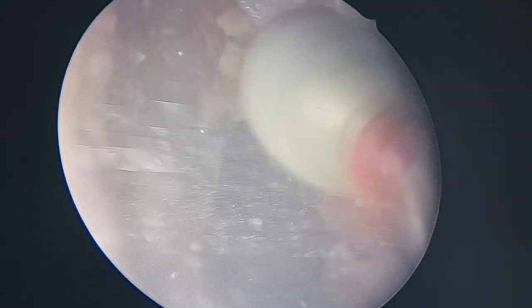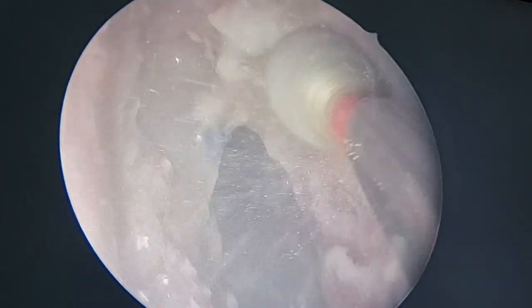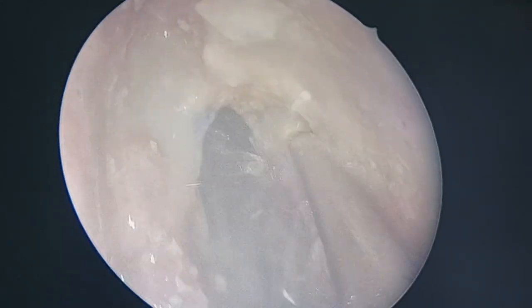See this way. Keep removing this thick bone. In our theater, we accomplish it in almost 10 minutes on one side.